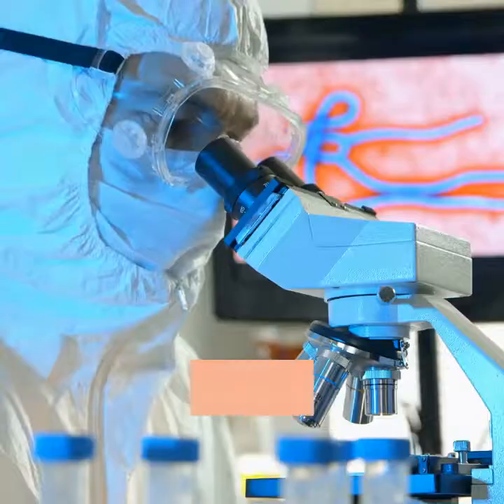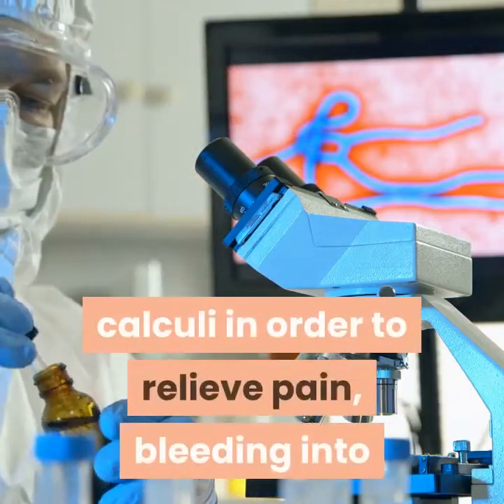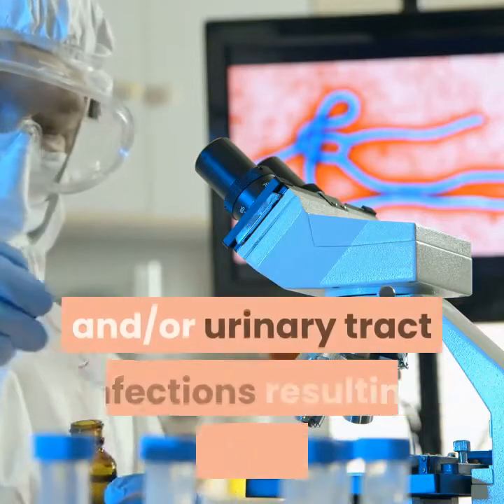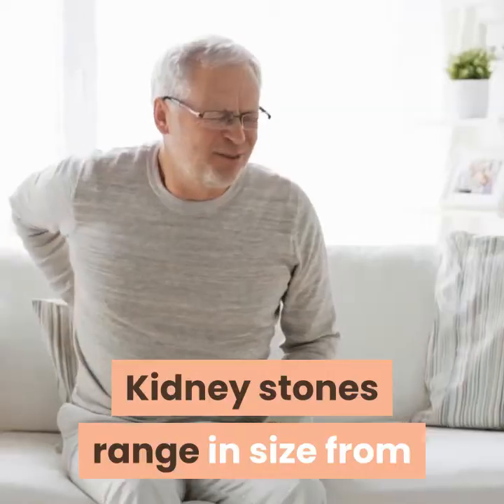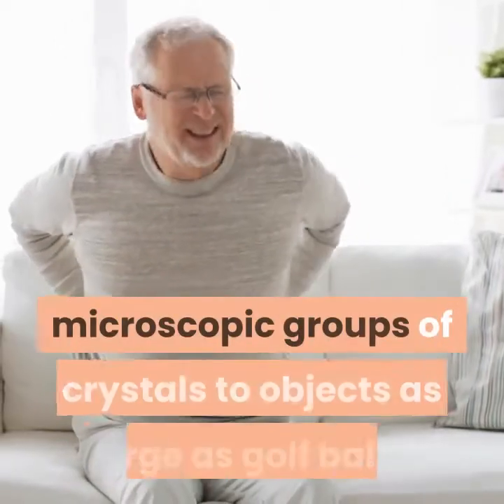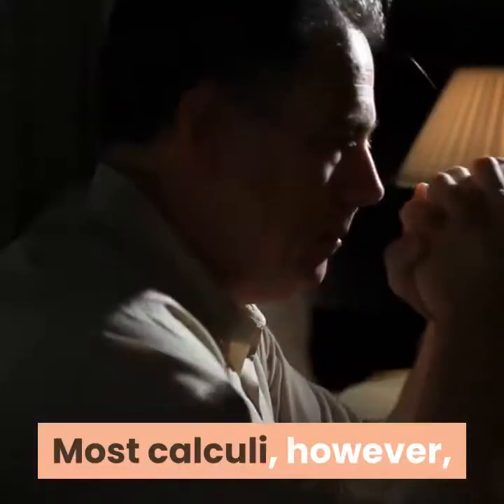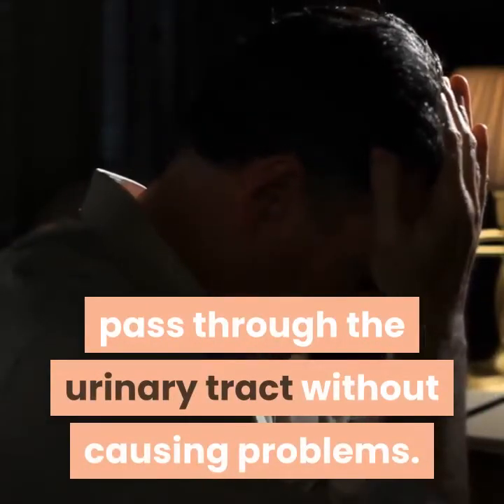Purpose: the purpose of PCNL is the removal of renal calculi in order to relieve pain, bleeding into or obstruction of the urinary tract, and/or urinary tract infections resulting from blockages. Kidney stones range in size from microscopic groups of crystals to objects as large as golf balls. Most calculi, however, pass through the urinary tract without causing problems.